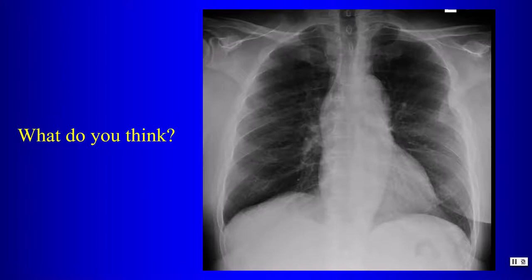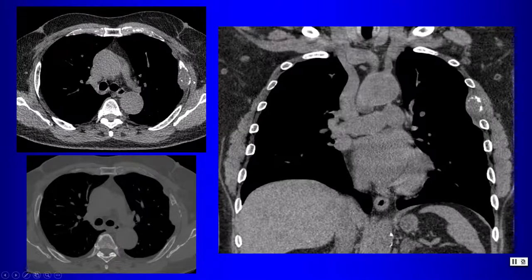The most important thing to look for when you have a lesion that is touching the chest wall is rib destruction. If we look carefully here, we can see this rib clearly, we can see this rib clearly, but a portion of this rib appears destroyed. Given that finding, we would put metastatic disease, neoplasm, possibly myeloma or plasmacytoma if it's an isolated lesion, high on the differential diagnosis. And here on the CT, we can see rib destruction in this lesion. This was an example of multiple myeloma causing an expansile lesion in the rib in this case.